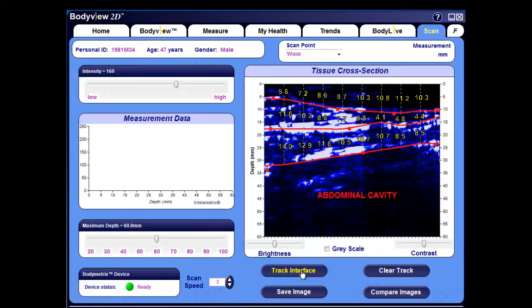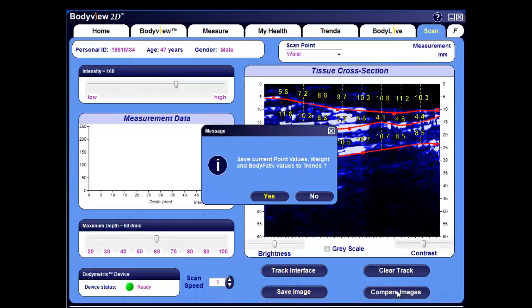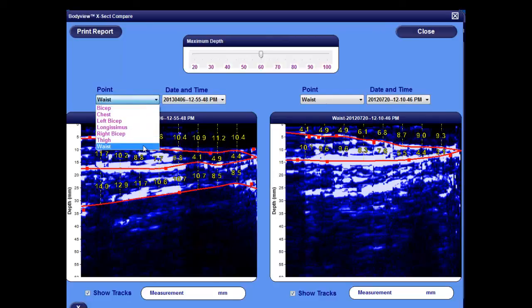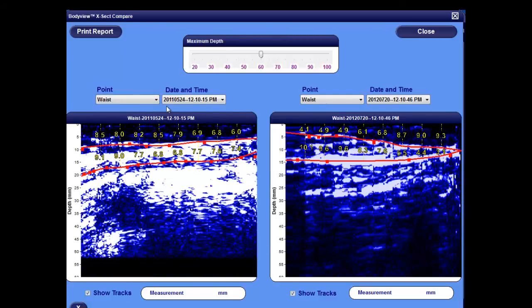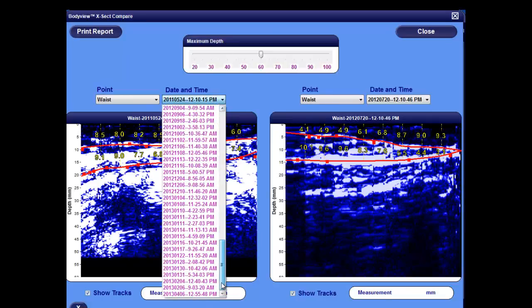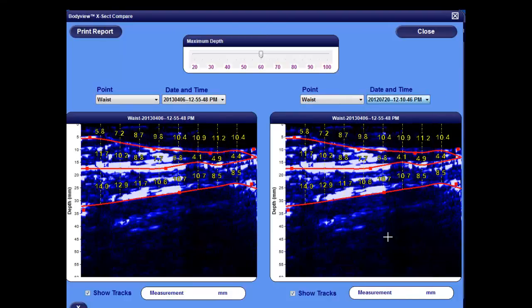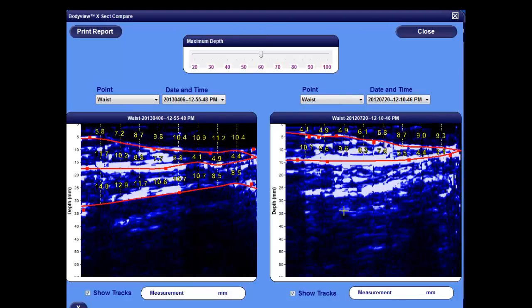You can save the image by selecting the Save Image button, and compare changes in adipose layers by selecting the Compare Images button. You'll be prompted to save the changes, so be sure to select Yes. From the drop-down menu on the left, you can select the waist scan point, and then select the date and time of the image that you're interested in, possibly an initial baseline image of your client's waist. On the right side, select the waist point and the date and time of the scan image you want to compare it with.